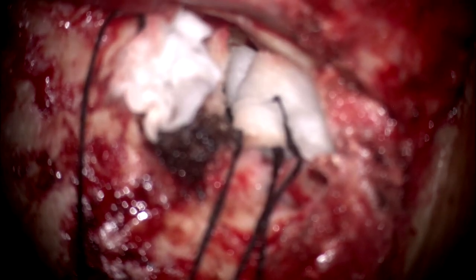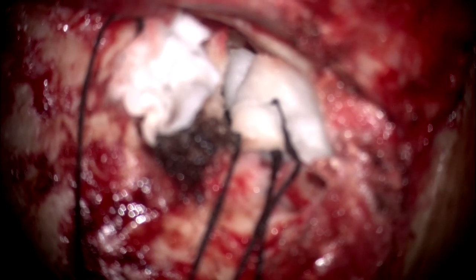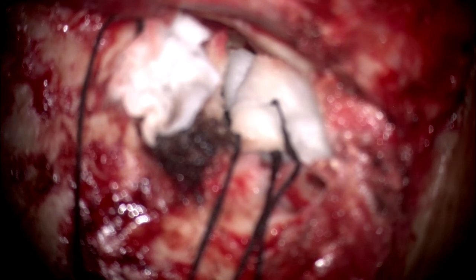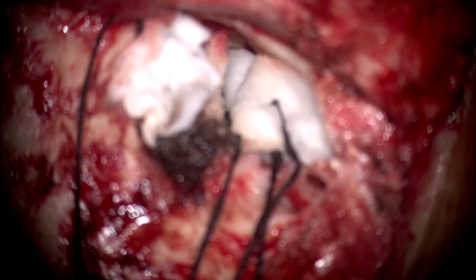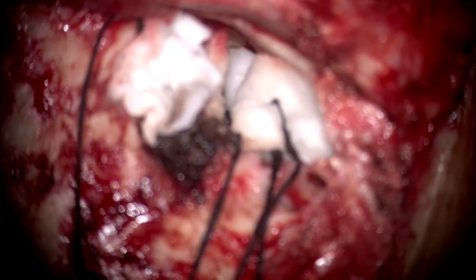Is it through any other opening, or through this wound that we will be exploring that hematoma, or will it be a craniotomy? Pardon? If accidentally some post-operative hematoma happens, will you be doing a craniotomy to relieve it, or will we be exploring through this wound itself? That is the beauty of the translab. You can go back to the same area in minutes. Just remove the postaural wound, remove the fat, and you are right at the CP angle in no time. Okay, sir. That's the beauty.